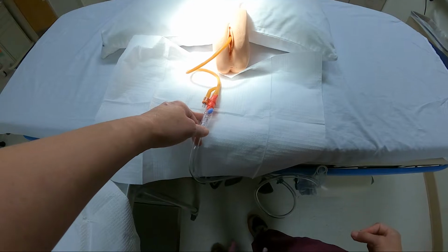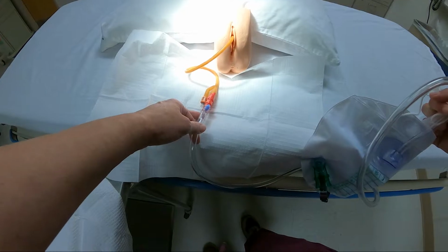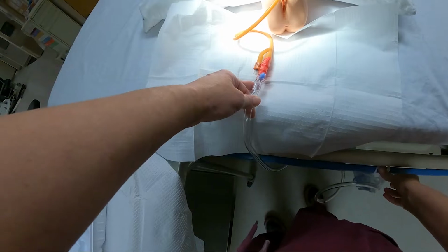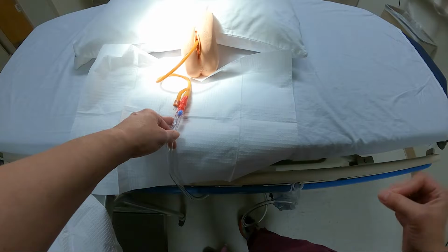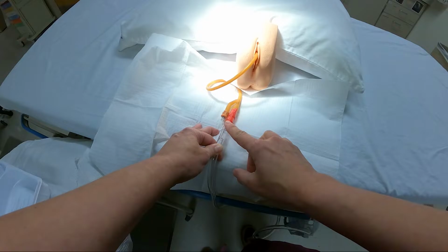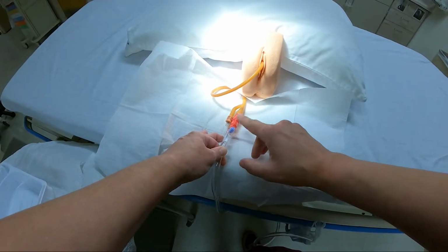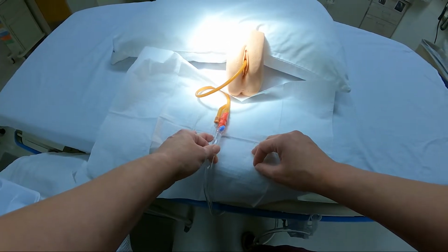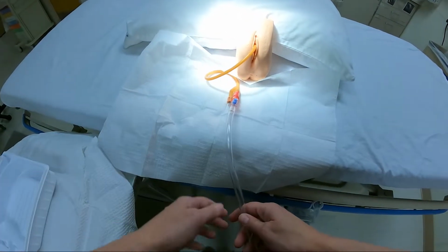If you're drawing a urine sample, you can draw it from the bag if you've just put the catheter in right this second. Once you hang it on there, you have maybe 3.5 nanoseconds. But the point is, if you don't draw it out of the bag when you first put it in, then 30 minutes later, when you come back, you need to draw it from this port right here. So use a 10 cc syringe, hook it on there after you scrub down the hub with either a chlorhexidine wipe or an alcohol wipe, but you need to use friction and scrub it well. Then put that on there.